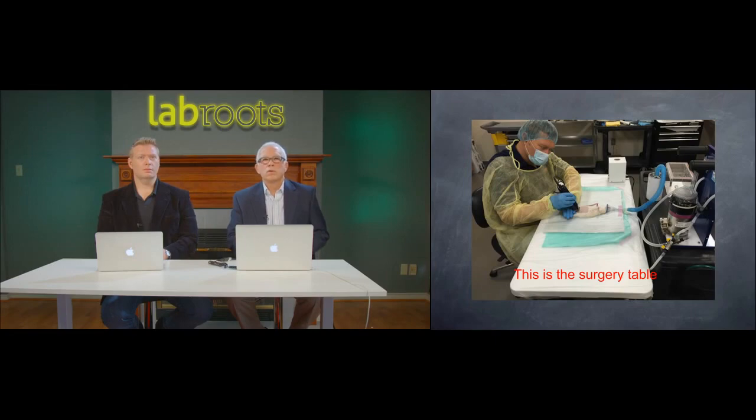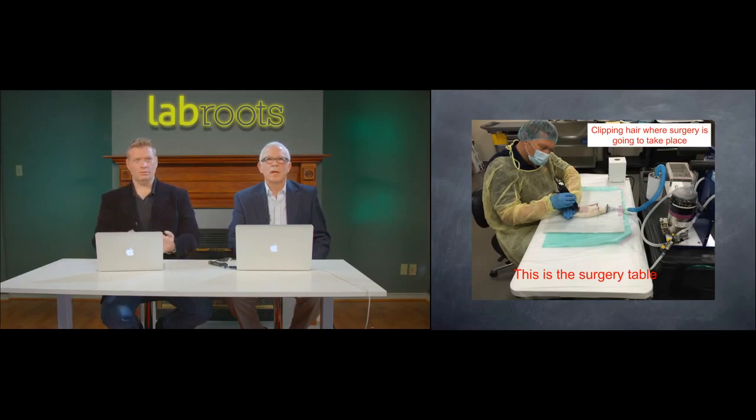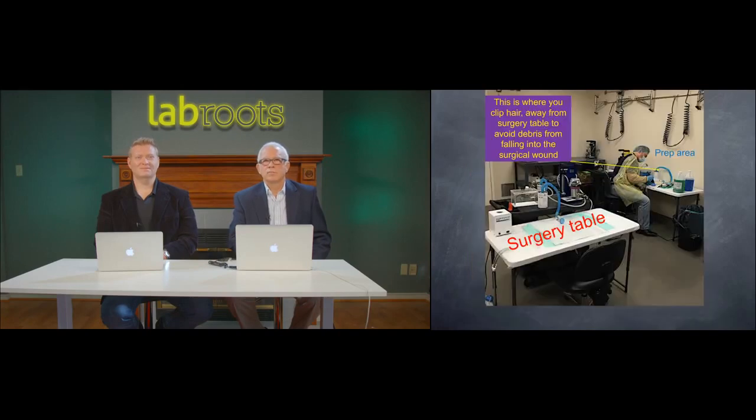Where does hair go when you clip? It sort of spreads, it becomes airborne, the dander becomes airborne, infectious particles and all that. And what does gravity do? Whatever goes up, comes down too, right? So we need to be very careful where we prep the animals. So we're going to give this a bad face. Mitch, we have to improve on this, which Mitch did.